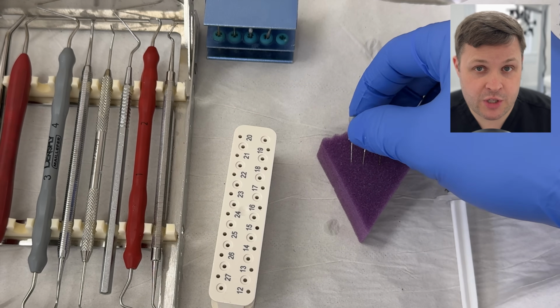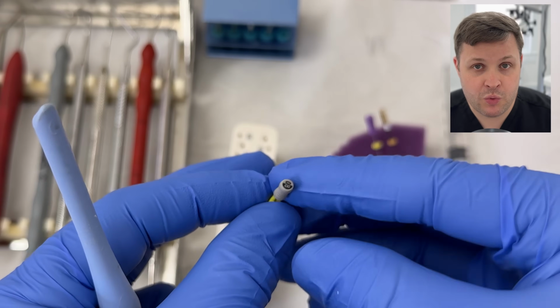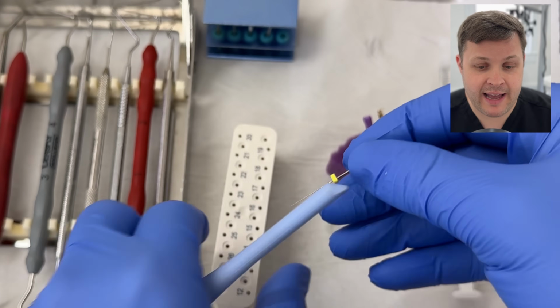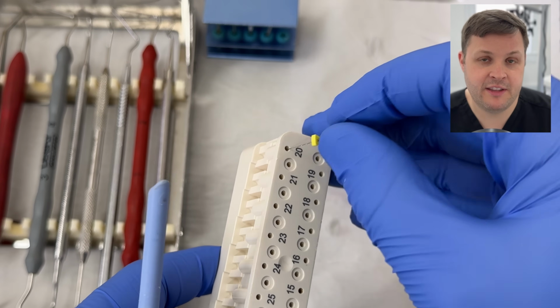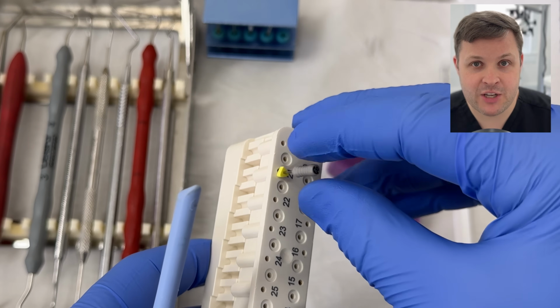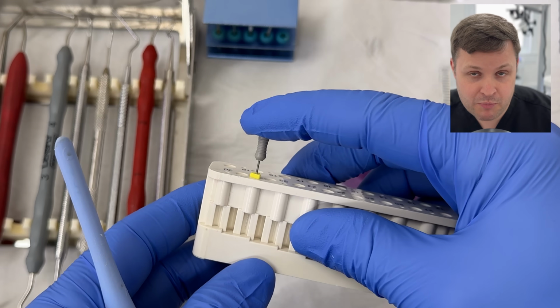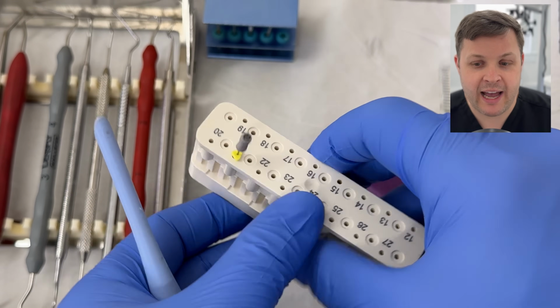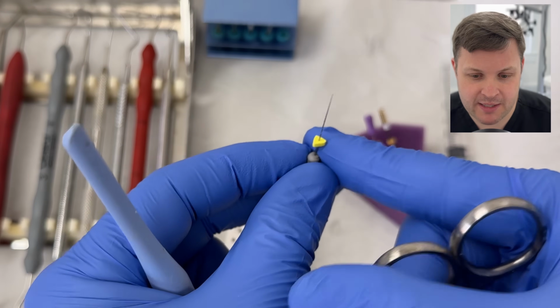So then to negotiate down the palatal, I'm going to pick up a D-finder. These are smooth bore files, they're narrow, and I'm going to measure this up to 21. So rather than 19, I'm going to measure it a little bit further, because when I'm negotiating down there, if the stopper is moving towards the cusp, I know that I'm negotiating and getting a little bit further without hooking it up to the apex locator.